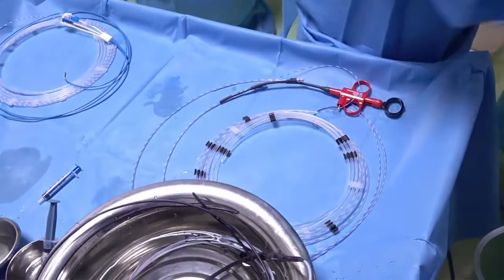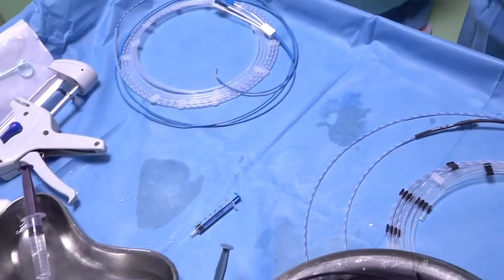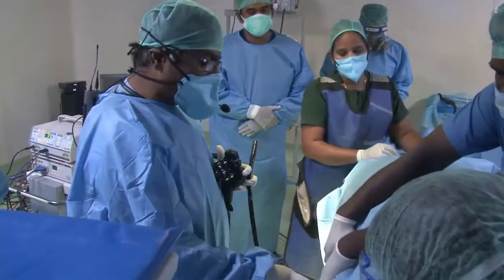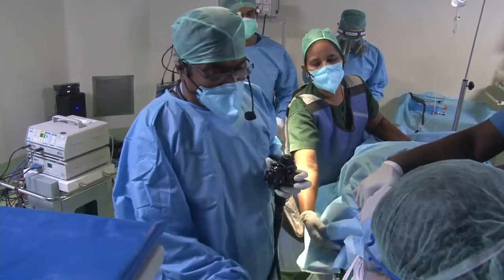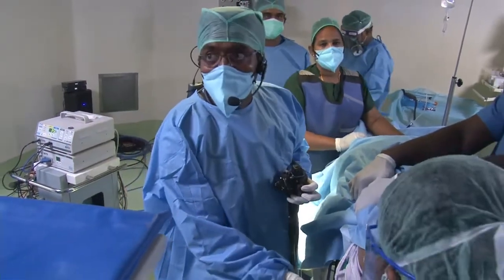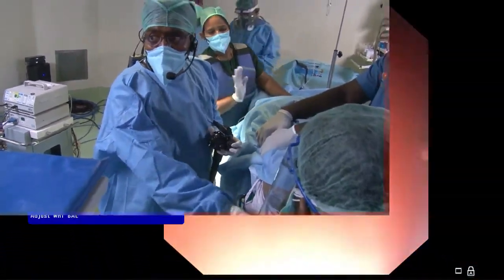intubation. So the patient is in a prone position. There is one more person I'm asking just to take the shoulder, making the patient semi-prone if possible, like this. If it is done, then lateral intubation is easy in the slightly lateral position. And you can easily go into the esophagus.